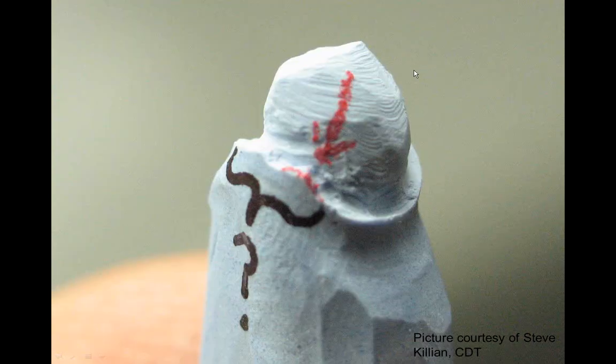So be careful with what you're doing. Some of those other little holes in the impression turn up. You can see them over here right on this central where it's leaked through and left a big blob. That's the kind of stuff we've got to be careful of also.